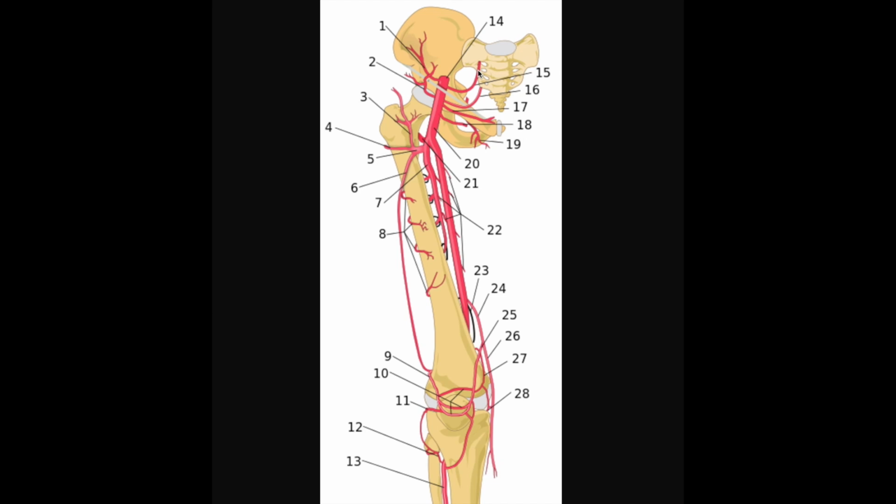That treatment would be called an inferior epigastric embolization. Sometimes we do see the bleeding during the angiogram. Sometimes the bleeding has subsided, but we still treat in order to achieve control. One of the reasons we treat is that the patient will need to resume anticoagulation at some point, and by having some plug there, we minimize the risk of this patient having an additional bleed.